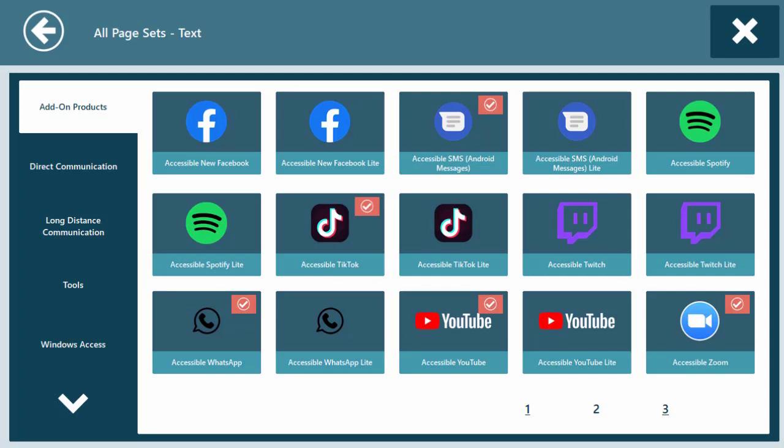On this screen, you'll find the accessible apps. Select an app and select Add to Homepage.